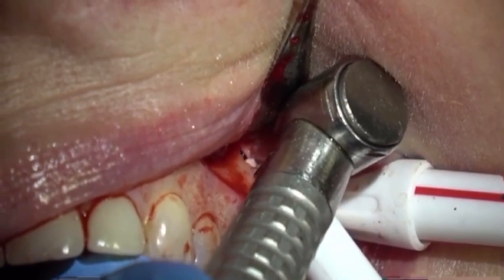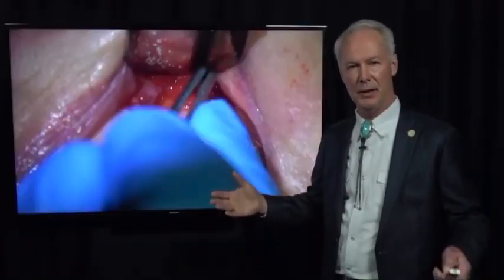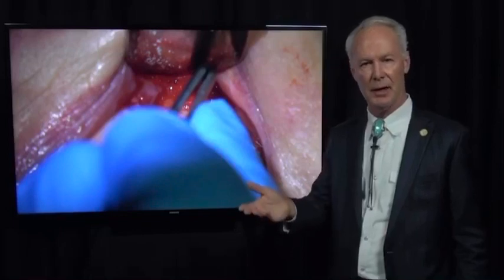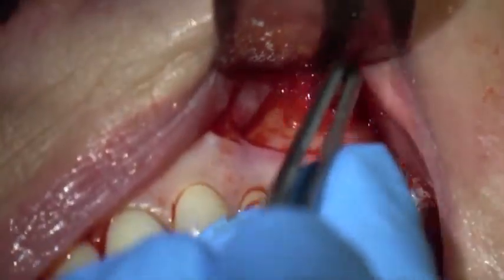Sometimes these roots will be into the sinus — don't worry about that if it happens. Many first molar teeth that are extracted have roots in the sinus and you have an oral-antral communication. In those cases, you just want to place the patient on antibiotics, a decongestant, an antihistamine, and a nose spray for about a month, and tell them not to blow their nose for about a month or two. But it's a common thing.